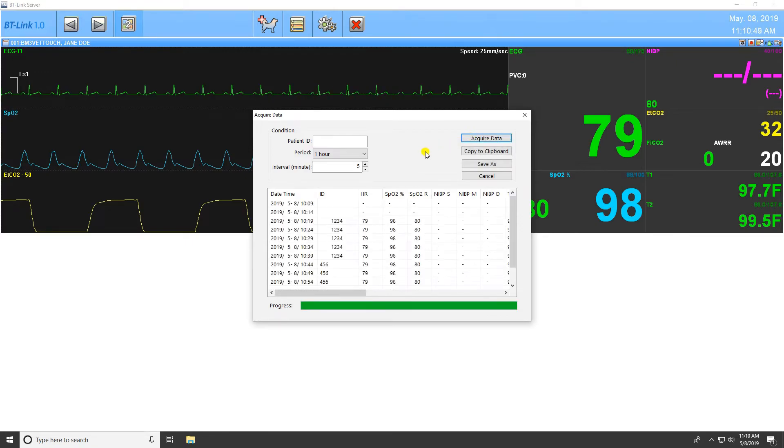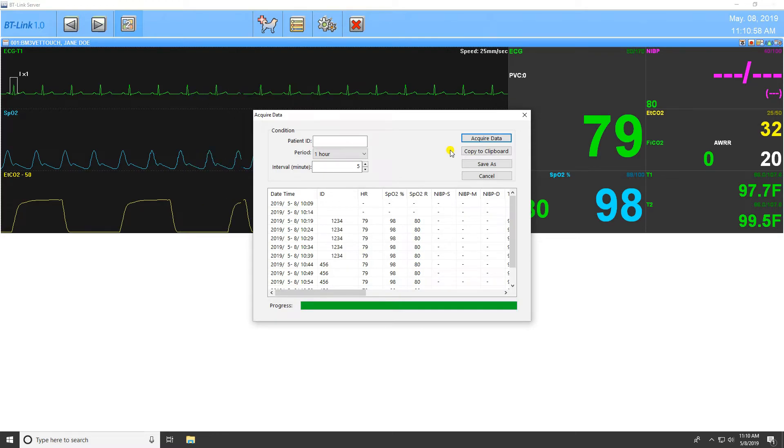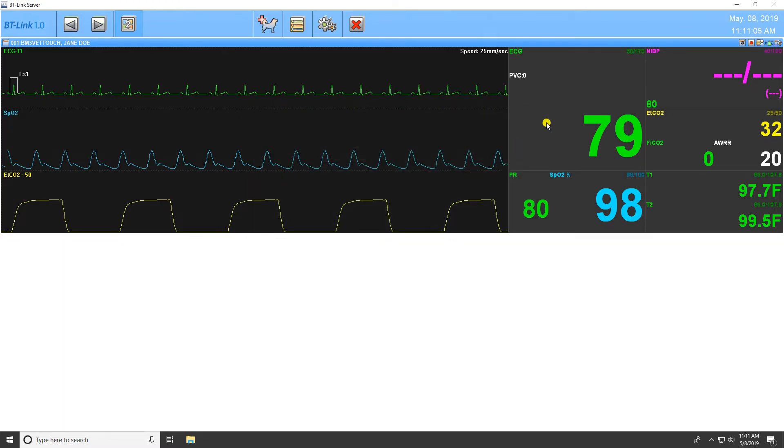Once the patient ID has been input and the options made, press Acquire Data to have this data displayed on the screen. From here, you may press Copy to Clipboard to copy this data into your computer's temporary memory for the purposes of pasting into a separate document, or Save As to create a CSV file on your computer. Cancel will close the Acquire Data window.